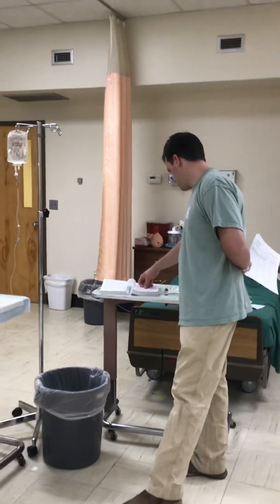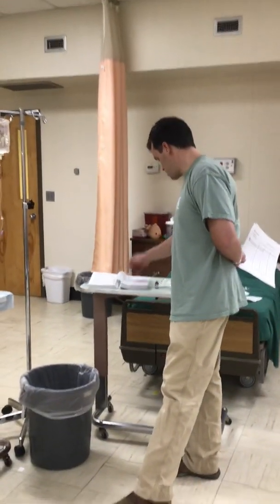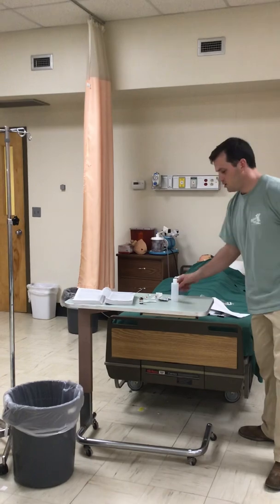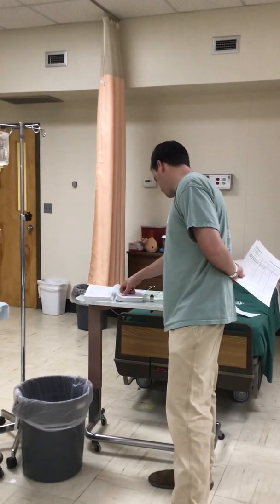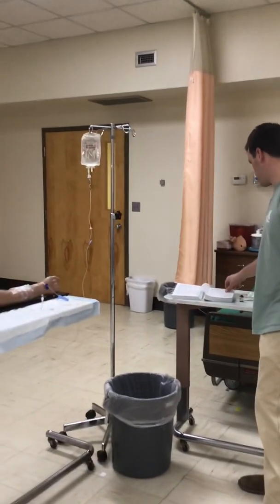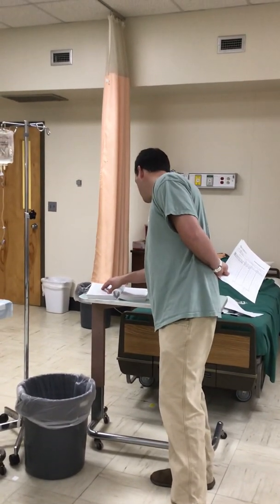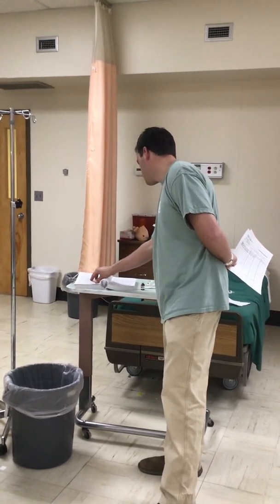The dilution does not have to be further diluted, so I can draw it directly from the medication here. For compatibility, I'm just making sure that it is compatible with the D5W that is running here. And I can see that it is.